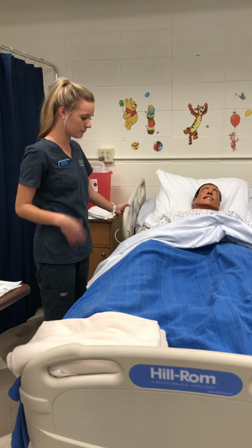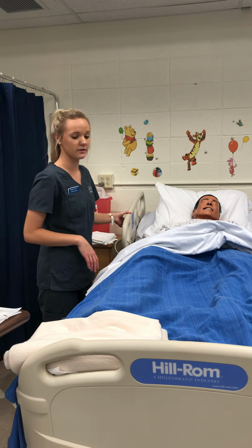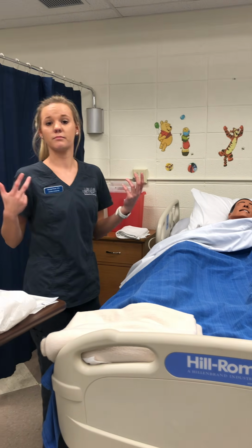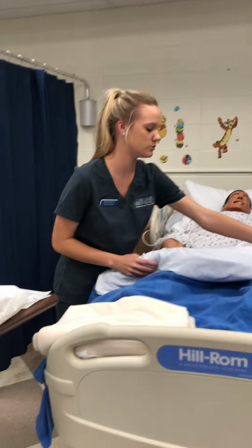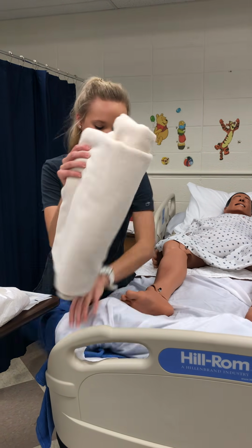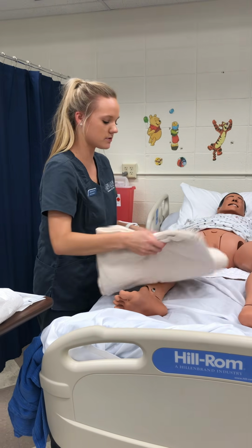I'm going to tell my patient, Mr. Jones, the doctor ordered for us to put a catheter in today, okay? Lay him down in the supine position. I would tell him exactly the process of putting the catheter in and why we're doing it. And I'm going to go ahead, Mr. Jones, I'm going to expose you, okay? Expose my patient. Brought a bath blanket to provide for as much privacy as possible.